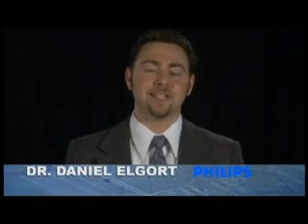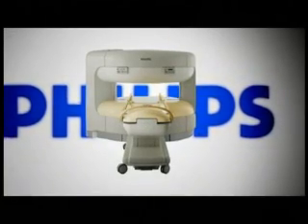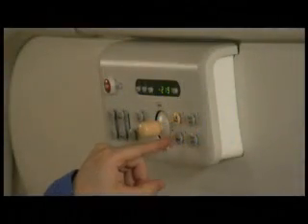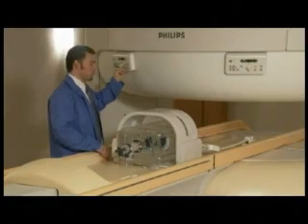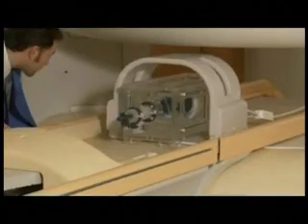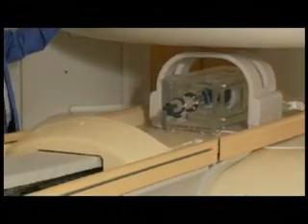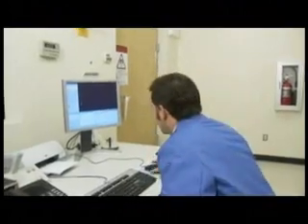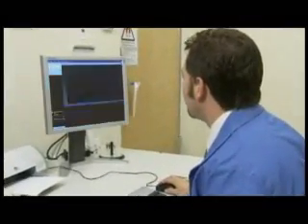I'm Dr. Daniel Elgort. I've been developing MRI imaging and reconstruction methods for diagnostic and interventional cardiac applications for nearly 10 years. The primary challenge for these MR researchers continues to be that many of the important cardiac anatomical structures are small, geometrically complex, and of course, they are constantly moving. This phantom provides a realistic model of the human heart that is capable of reproducing these critical features.